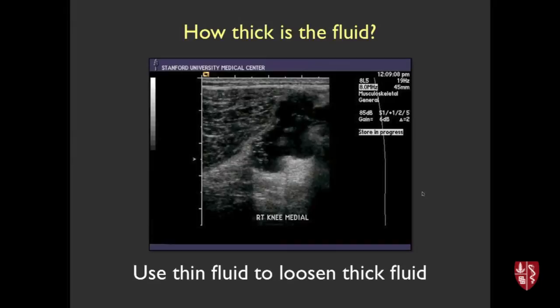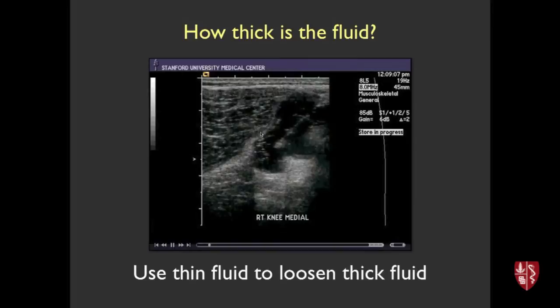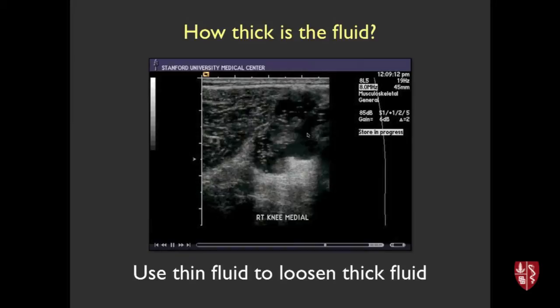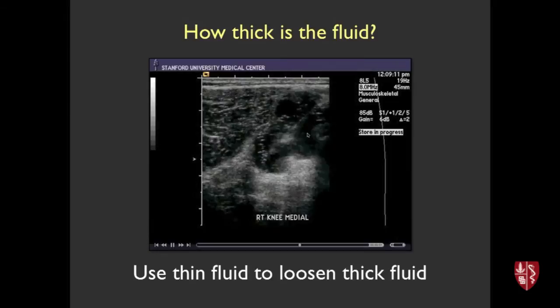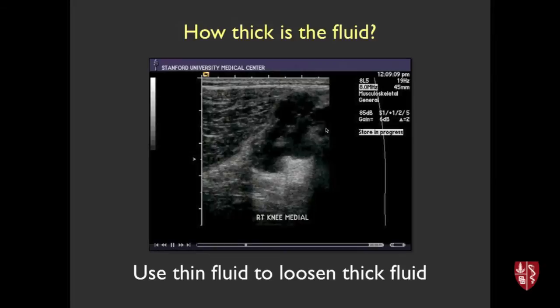The fluid can be fairly thick. Here's a different patient where you can see the lesion, and as we inject thin fluid you can get a sense of how viscous the fluid inside is. When we put a needle in, we may hook up tubing and lavage in and out — kind of rinsing in and out — and eventually that process thins the fluid and allows you to drain it all the way out, helping you avoid going to a larger needle.